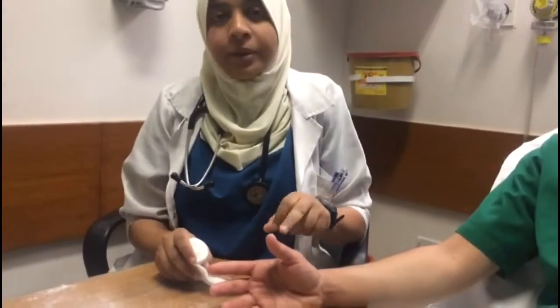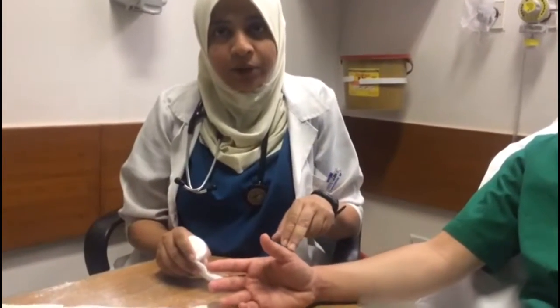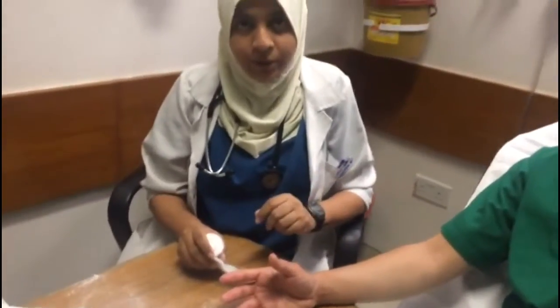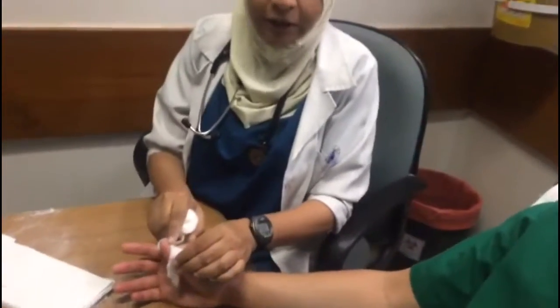The thumb spica applies to any dressing that encompasses a main trunk plus one or more of its branches — in this case, the forearm plus the thumb. Apply padding and splint material to the radial aspect of the forearm, covering the thumb.